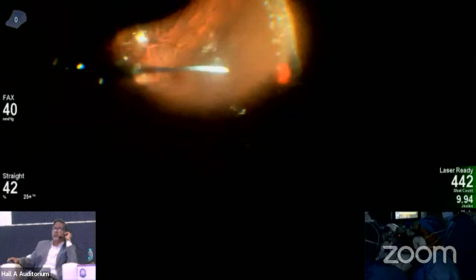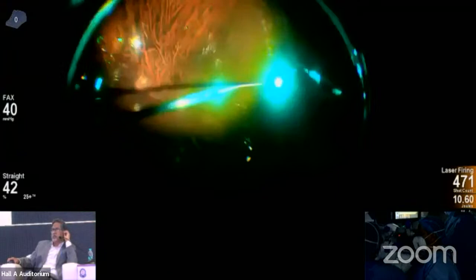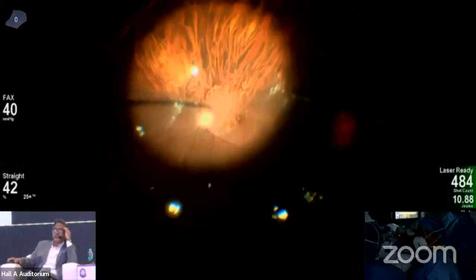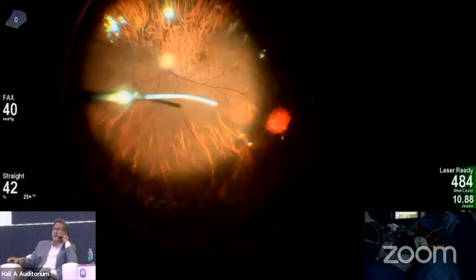Okay, so laser itself has some disadvantages. Sometimes excessive laser can also create a break, so that can also cause the detachment. That is the thing. So only an expert with titrated laser should do it. So if you notice, because the tear is large, I have done 4-5 rows, and normally I would do roughly around 3 rows. As you have seen all around, I have done around 2 rows, but in the area of the tear, because it's a very large tear, I have done around 4-5 rows, and there is no further fluid.